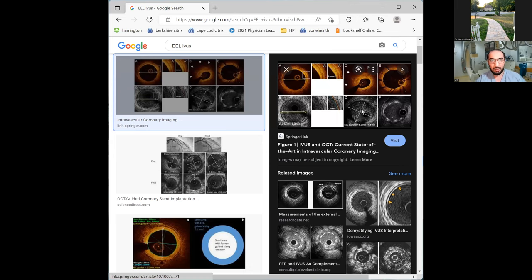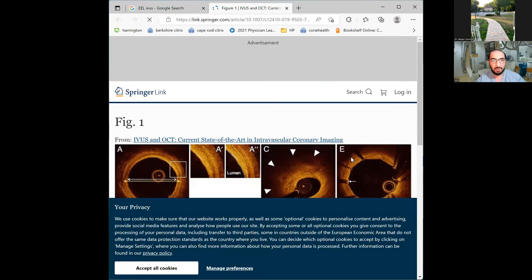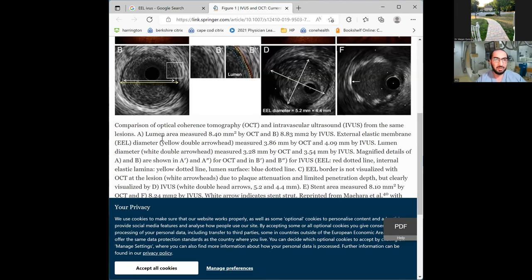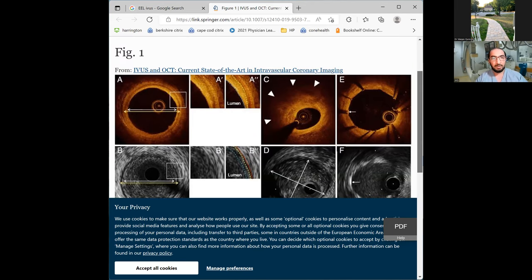These are wonderful images, though you may not see them as clearly on your own IVUS. The high-echogenicity dense black line — this one measures the EEL and this one measures the luminal diameter. You need to scan through the image to find where exactly to measure, as it may not be visible in the presence of plaque.